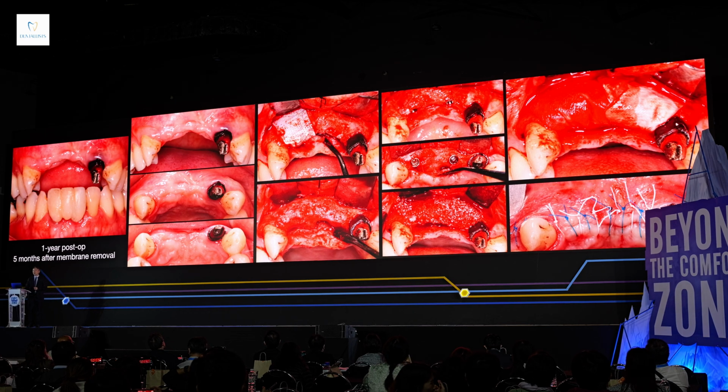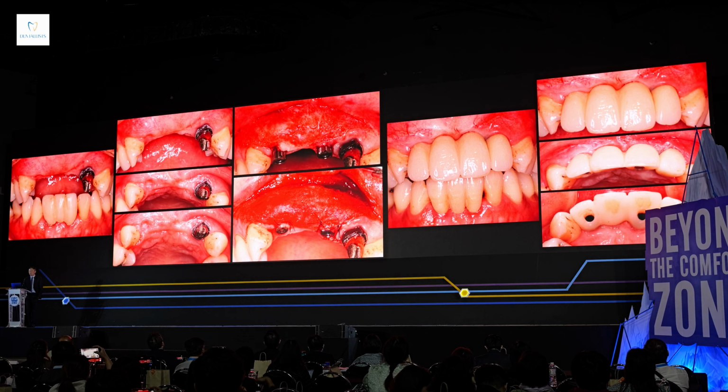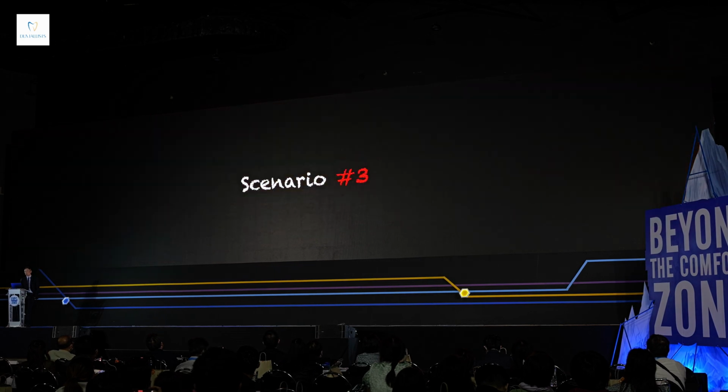So I placed the implants for an implant-supported bridge approach. And of course, I grafted connective tissue to augment the soft tissue for esthetics. This was one of the very first few cases where I did augmentation, and then I epithelialized and gained keratinized tissue. That's when I found this could be a good protocol. And I presented this protocol just 2 weeks ago at the American Academy of Periodontology annual meeting in San Diego, with a similar type of soft tissue approach.